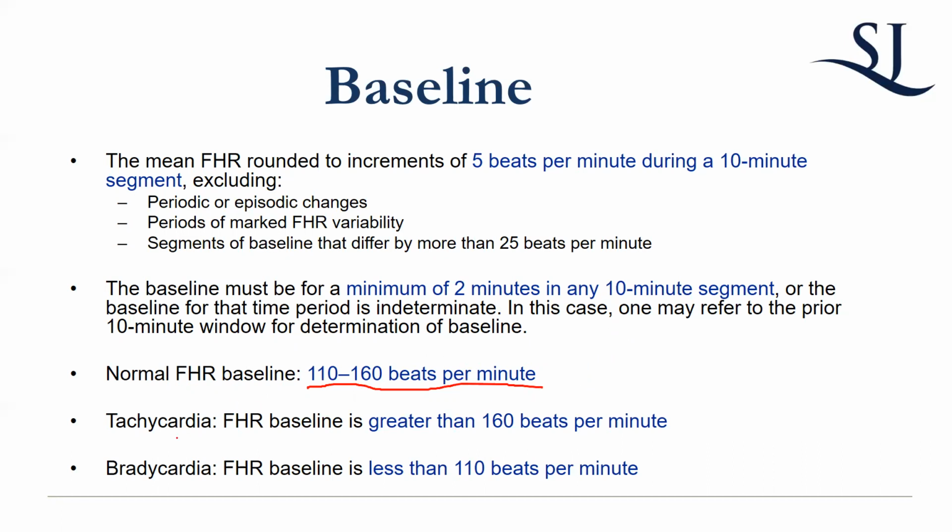Now, tachycardia for a baby is greater than 160. And what's a reason why a baby might have tachycardia? It's the most common reason, really.